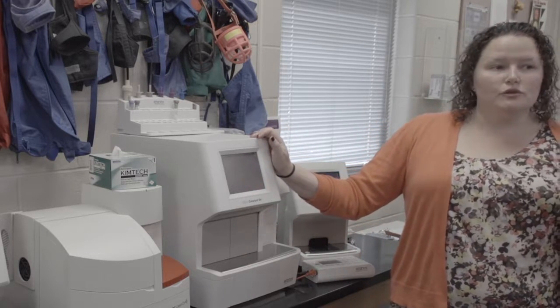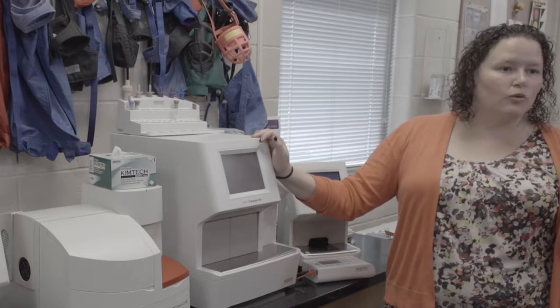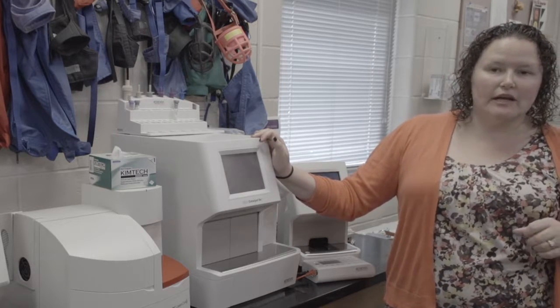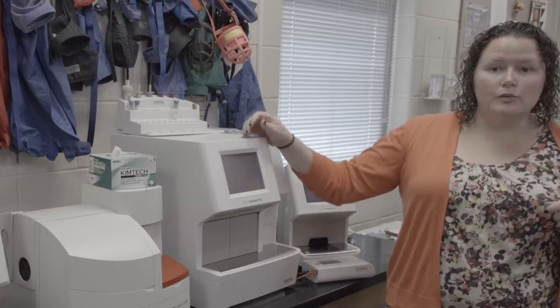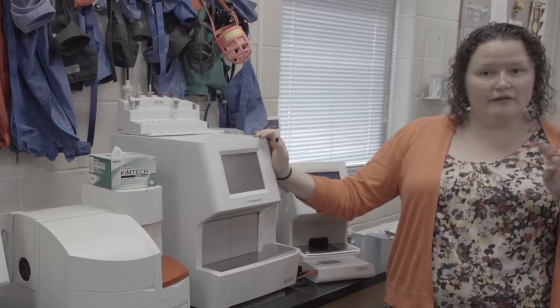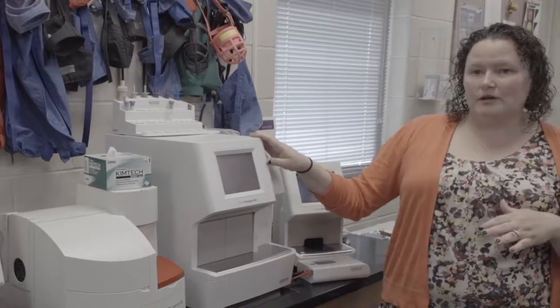Best practice is to remove your slides from the freezer right before running. So you don't want to let them warm up. You don't want to open them and have them sitting on the counter. They need to go straight from freezer straight to analyzer. As soon as the packages are open, they actually start to react within 2 to 5 minutes, dependent upon the slide. So the quicker you can get them in the analyzer, the better.